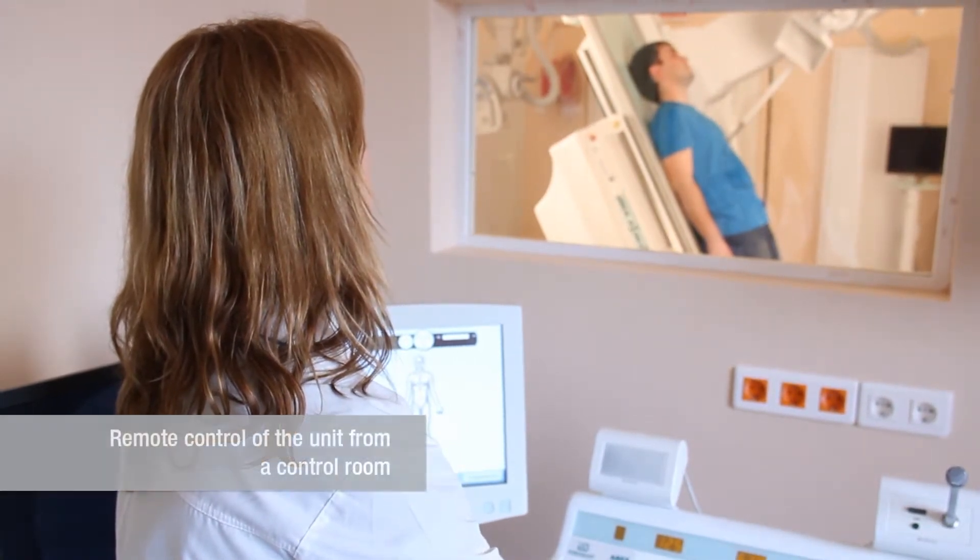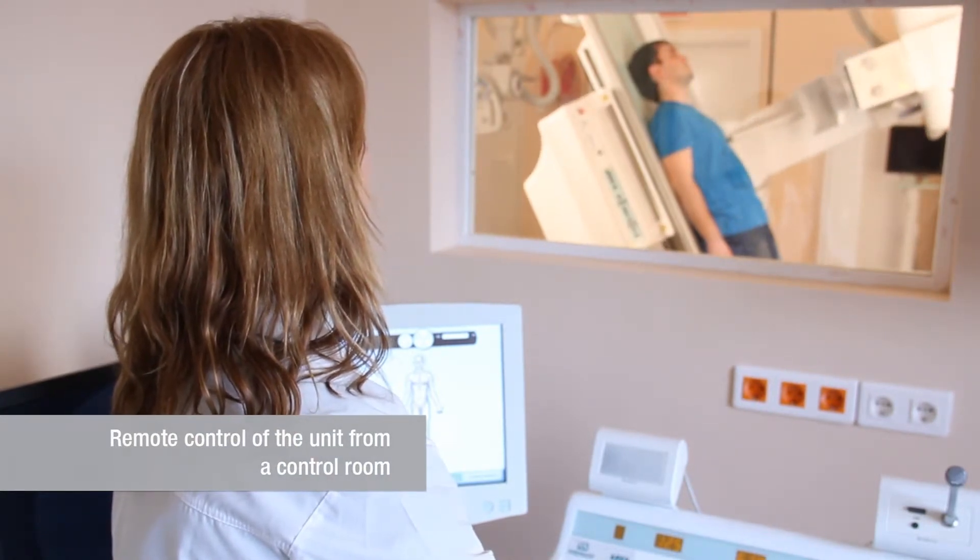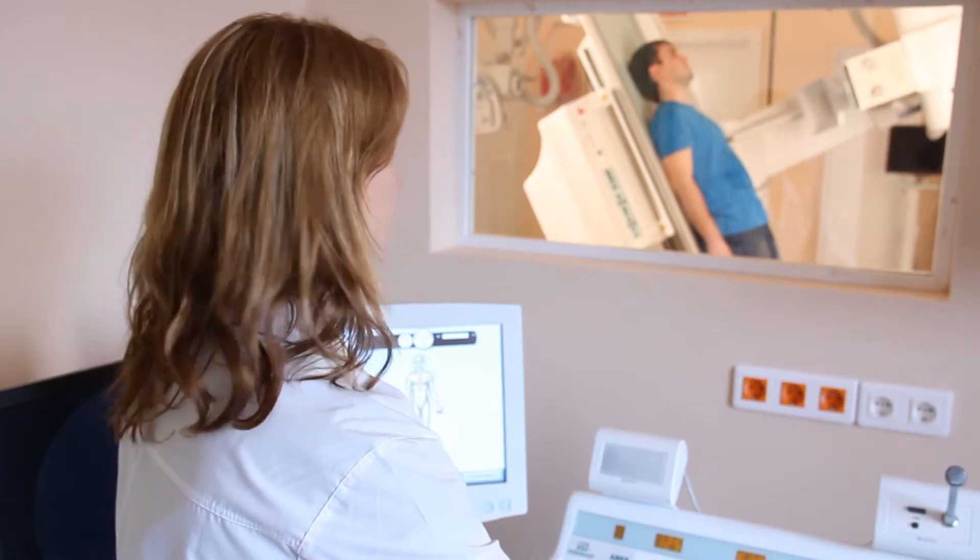Possibility of operating the unit remotely from a control room significantly reduces the radiation dosage for the personnel.